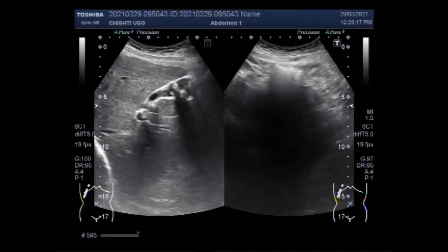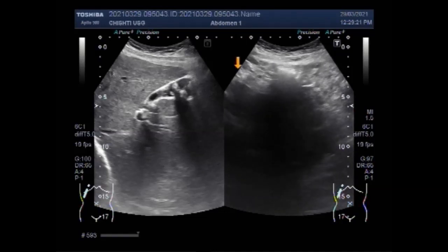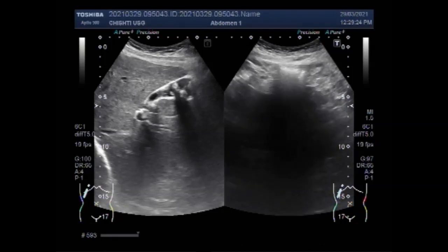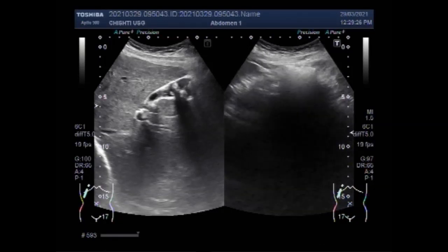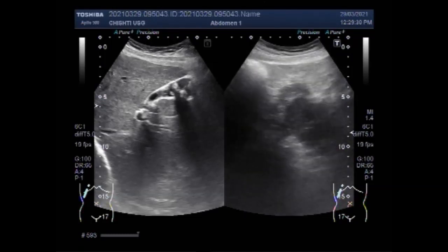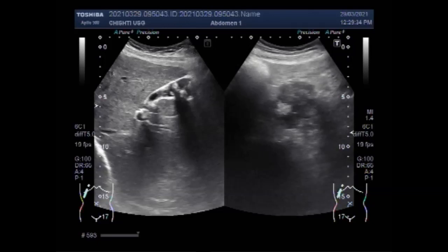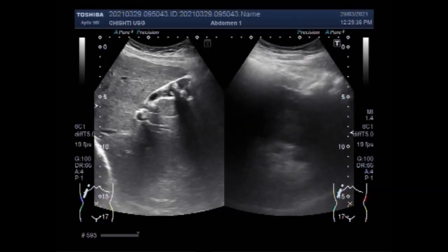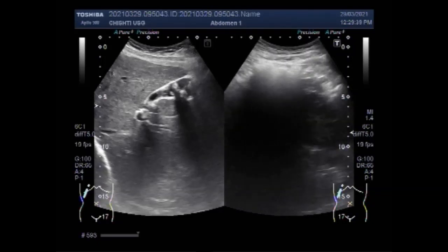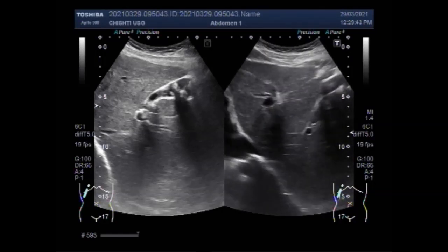Now you are going to see the liver, and a large mass is seen in the porta hepatis. The abdominal gas is obscuring the view of the liver, so you have to put the patient side-on to clear your view.